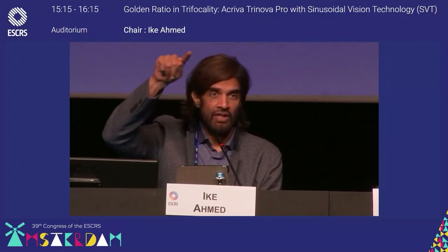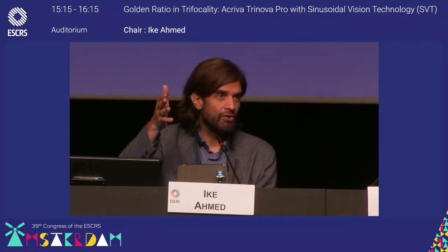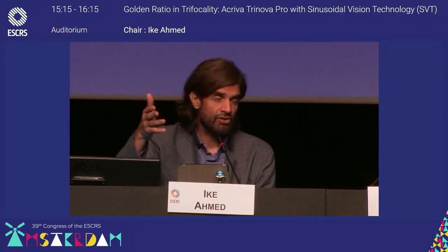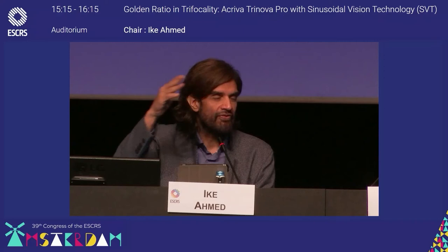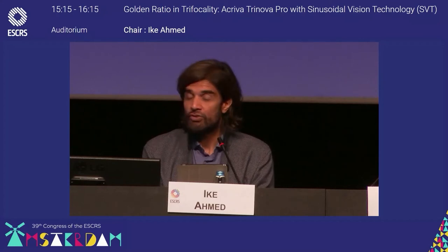Yeah, and I think that's important. We have to be confident with our formulas as well. And I totally agree. If you look at that defocus curve, if that patient ends up myopic, they have less focus reserve to use, and you're going to compromise the distance vision. So if you end up even a little bit hyperopic, they typically will be able to use some of that defocus to help. And that's what we want. We want to get that maximum distance focus. So I agree with that. That's true for most presbyopic lenses, and that's a very good question.